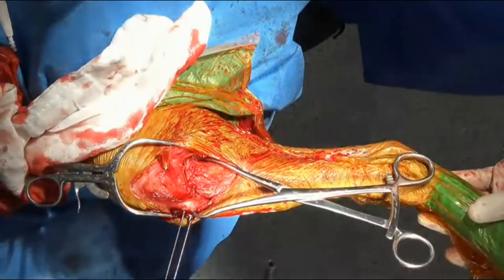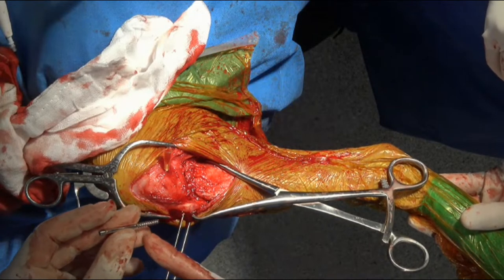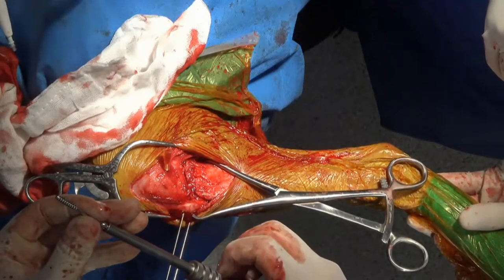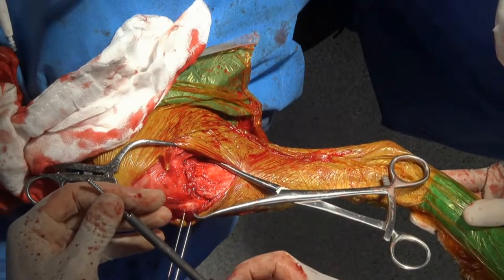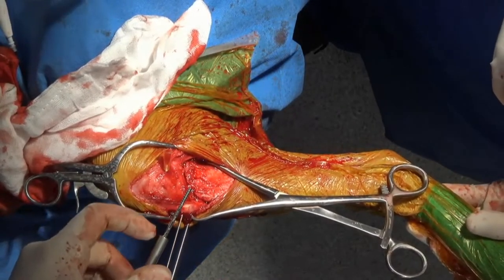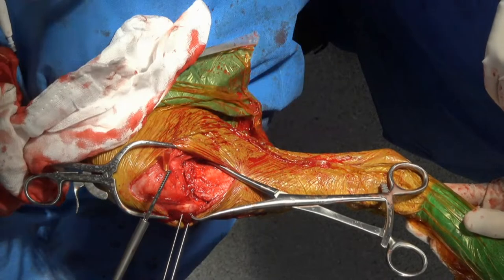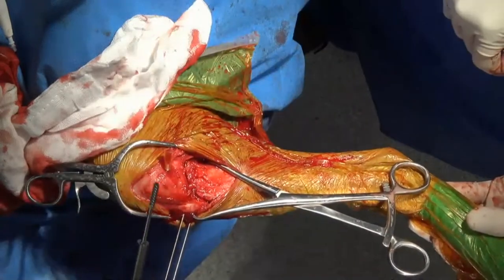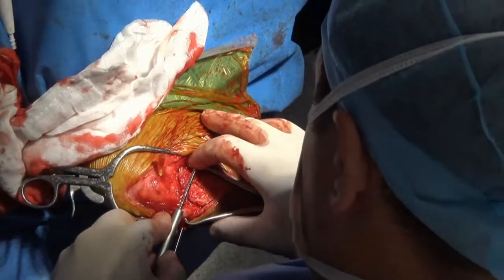These headless compression screws are cannulated, and so they've got different thread profiles. So as we put this in, the first thing we're going to do is lock the screw against the bone, and we're going to actually generate our compression, and we're actually going to unscrew the screw from the driver. So the screw goes into the driver, like this. We then drive it in, it engages, and then as we're tightening, it'll generate compression between the end of this driver and the screw and the bone. And then once we've done that, we put another screwdriver, this one, down the center of this one, and we drive the screw out of the end into the bone. So I'm going to check here and make sure that that's going to work out okay. I think that'll be pretty good.